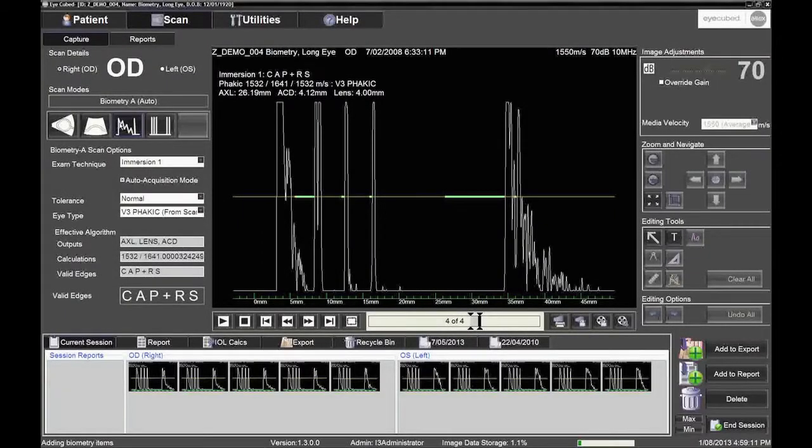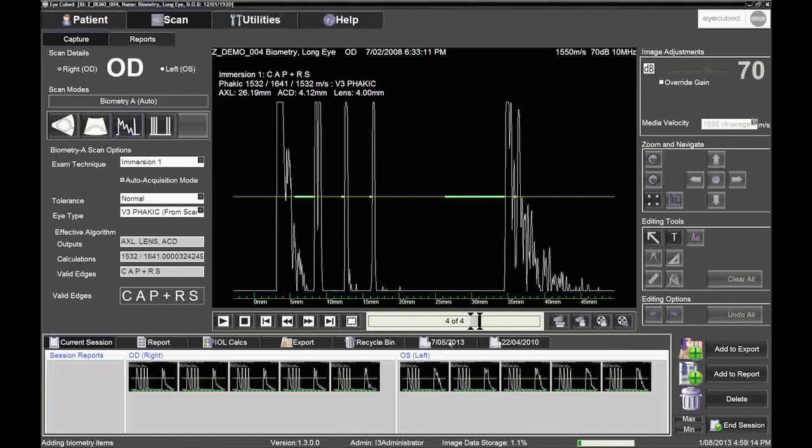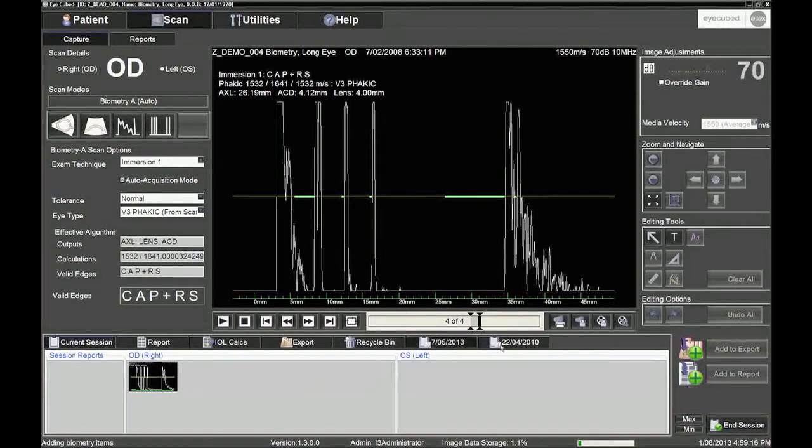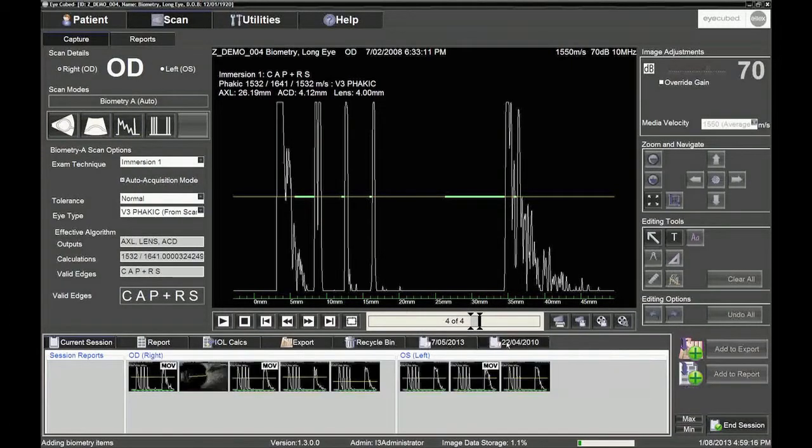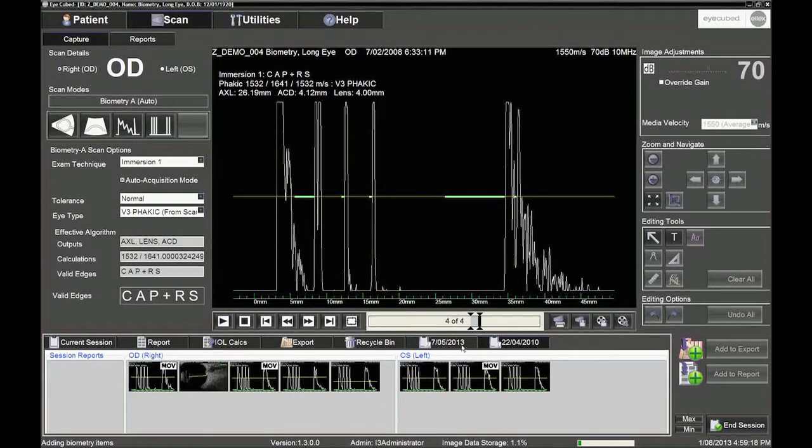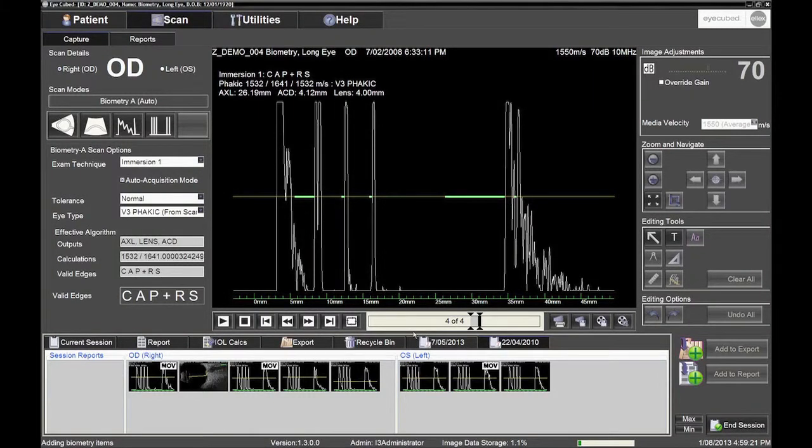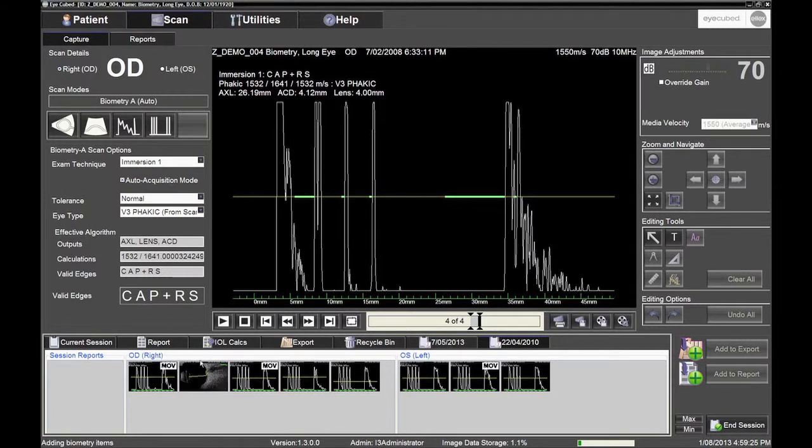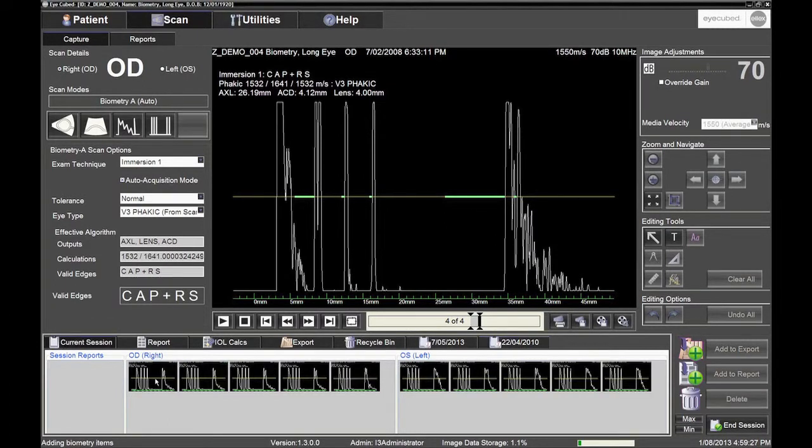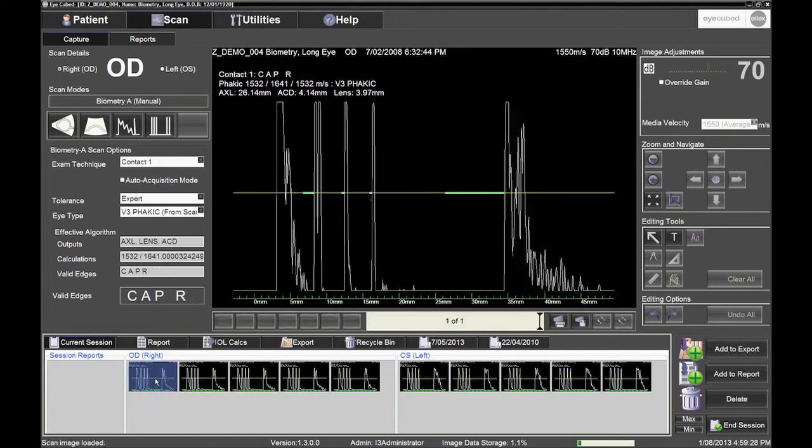First, access the biometry scans from the image tray. If biometry has been performed in a prior session, locate the biometry scans by highlighting the date of the exam and press Enter. Dates of prior exams are noted directly above the image trays at the bottom of the screen.